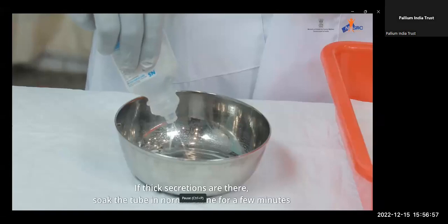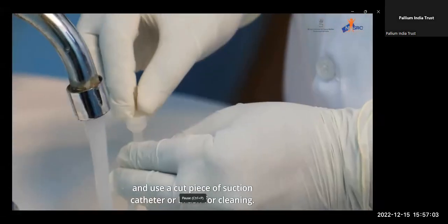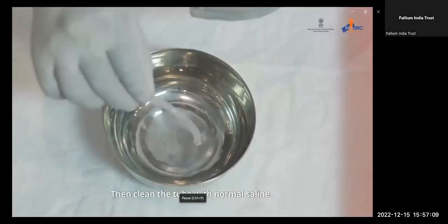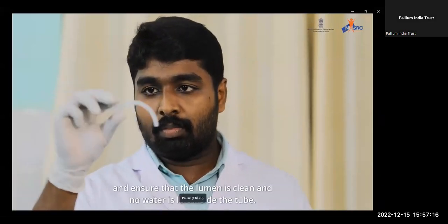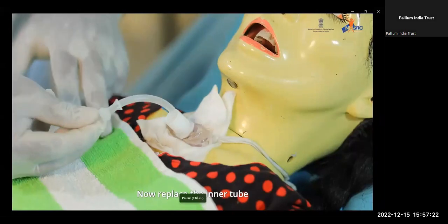If thick secretions are there, soak the tube in normal saline for a few minutes and use a cut piece of suction catheter or brush for cleaning. Then, clean the tube with normal saline. Gently tap the tube after rinsing with normal saline and ensure that the lumen is clean and no water is left inside the tube. Now, replace the inner tube.